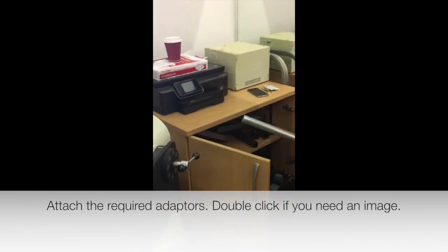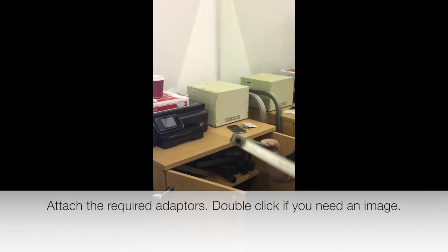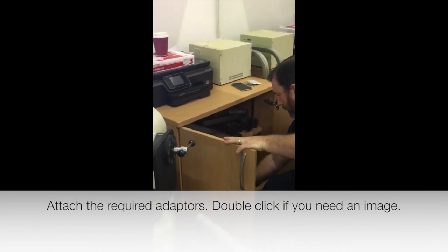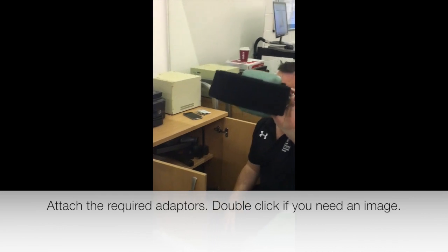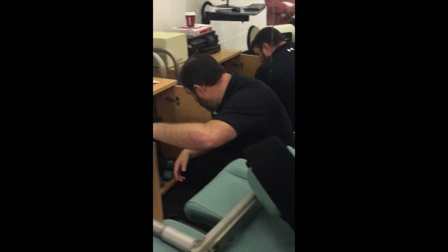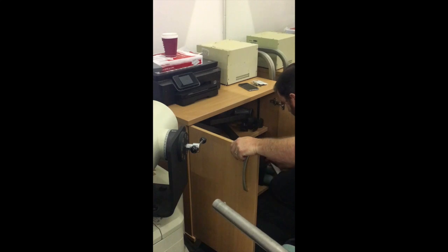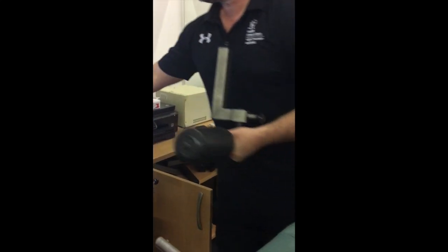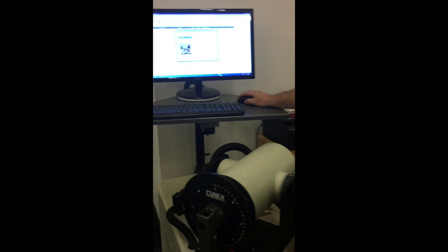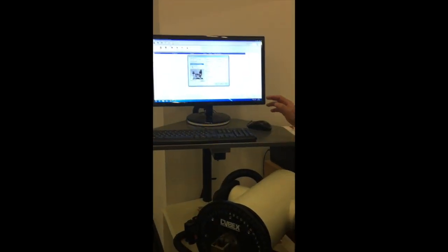that's your hip and knee stabilizer. Funnily enough, it says hip and knee adapter on it. You are looking for one of the pads. That's your hip and knee pad. That's your contralateral limb stabilizer. Again, it should say on there, but if not, just look at the picture. And then your lumbar cushion is already in there. Yay.